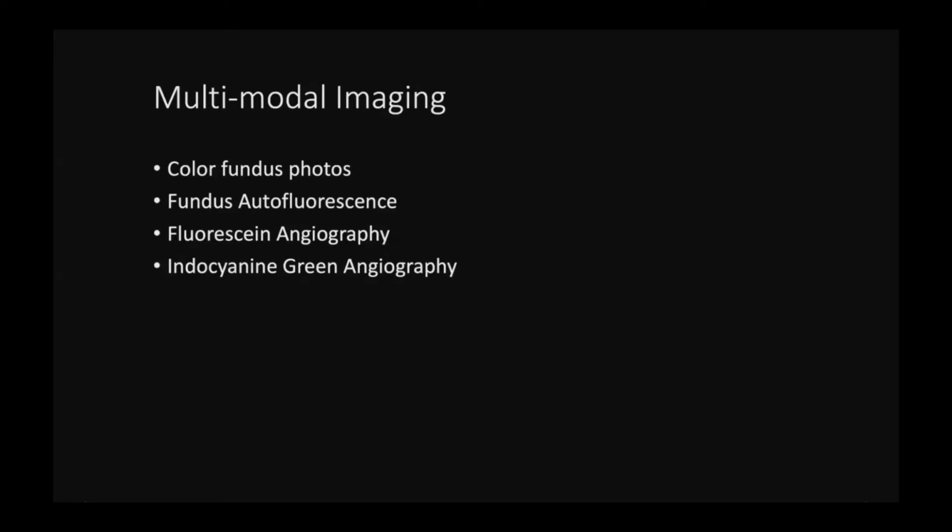So sort of to tie it all together, I use multimodal imaging often in clinic, both to make a diagnosis, to help understand the prognosis of disease, and to follow the disease over time.